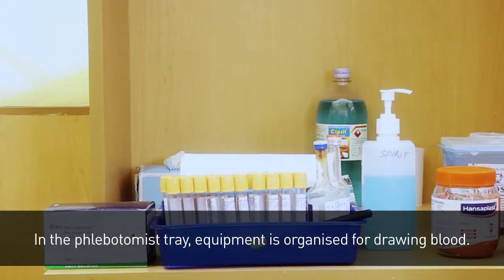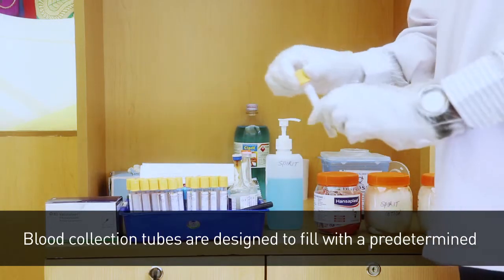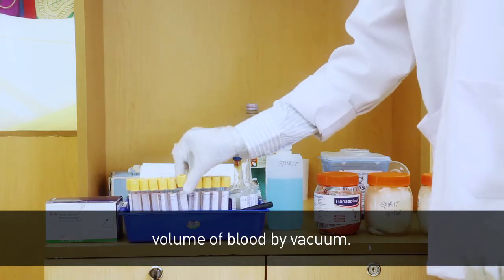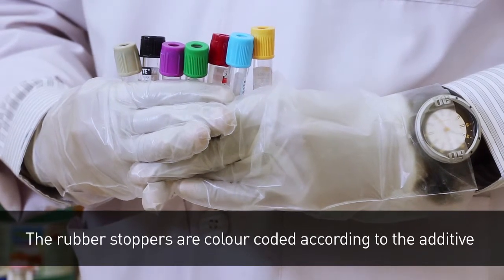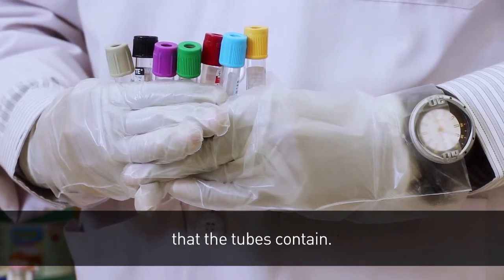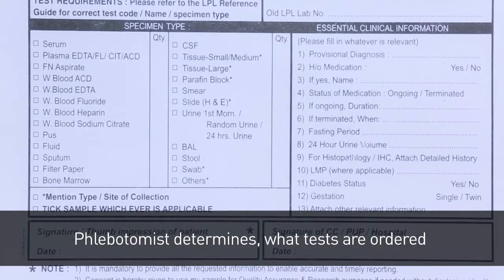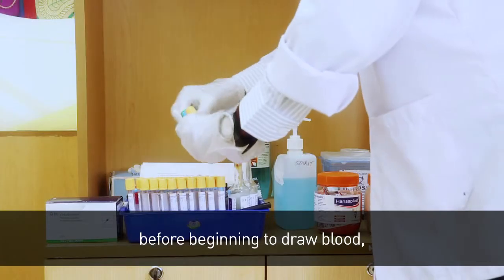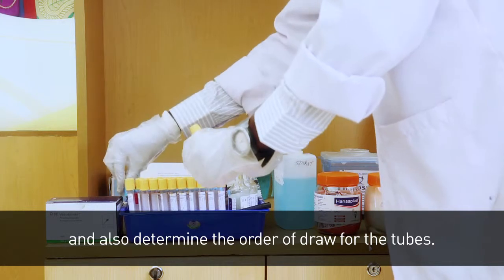In the phlebotomist tray, equipment is organized for drawing blood. Blood collection tubes are designed to fill with a predetermined volume of blood by vacuum. The rubber stoppers are color coded according to the additive that the tubes contain. The phlebotomist determines what tests are ordered and what tubes will be necessary before beginning to draw blood, and also determines the order of draw for the tubes.